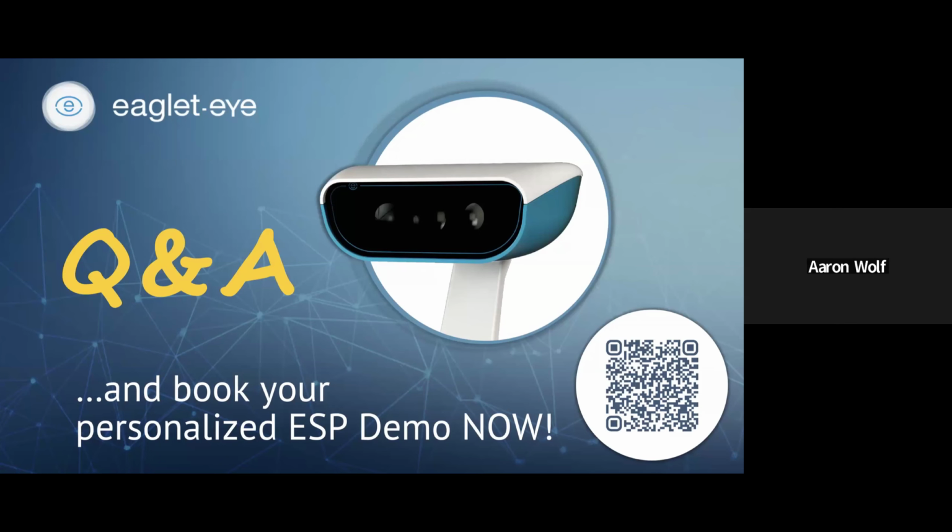KPI is basically a metric that uses multiple other metrics combined into a single metric, and essentially it's your percentage likelihood that what you're looking at is keratoconus. So the answer is yes, it does have KPI, which is a very common keratoconus metric.